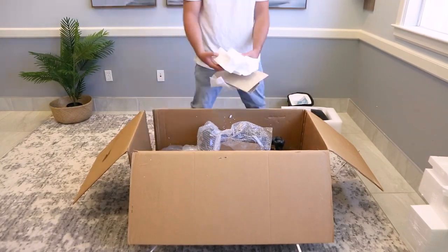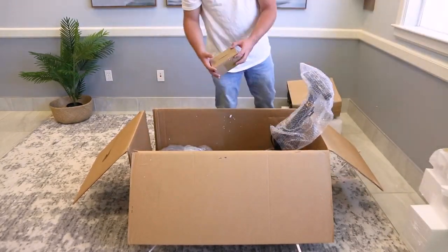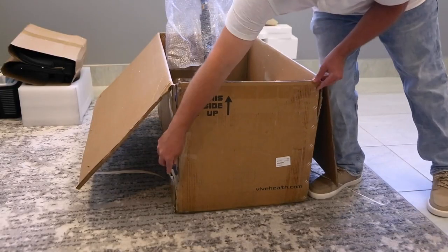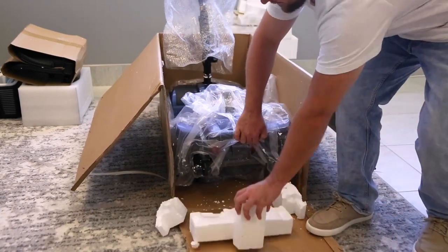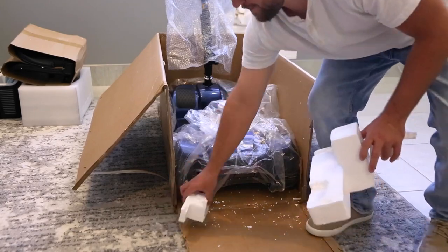Lift up the steering column of the scooter and grab the seat and set that aside as well. Now you will cut the side of the box the back of the scooter is against. This will help you pull the scooter out with ease later. Remove the packing material that is blocking the scooter.